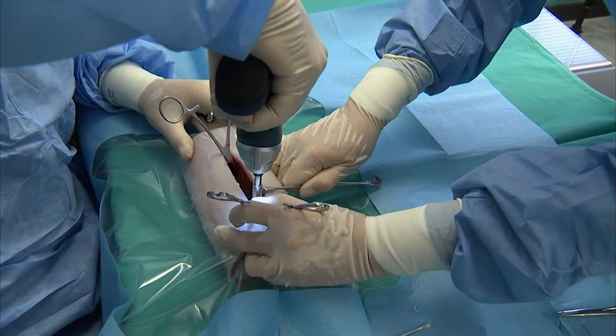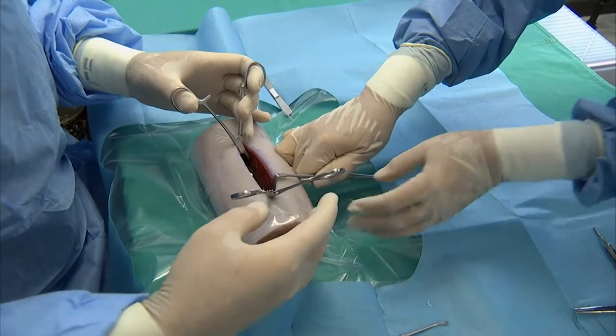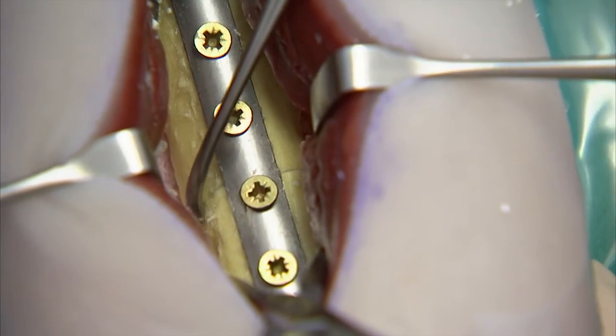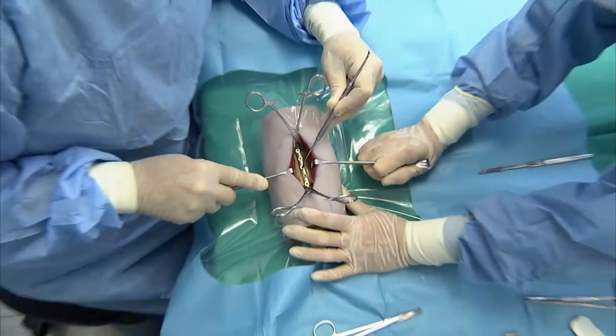Keep one eye on the fracture while drilling to ensure that the bone segments do not get displaced during the drilling procedure or while fixing the transosseous plate. Once all the screws are placed, inspect the fracture line again as well as the alignment of the bone. If you are unhappy, now is the time to correct a poorly reduced fracture.